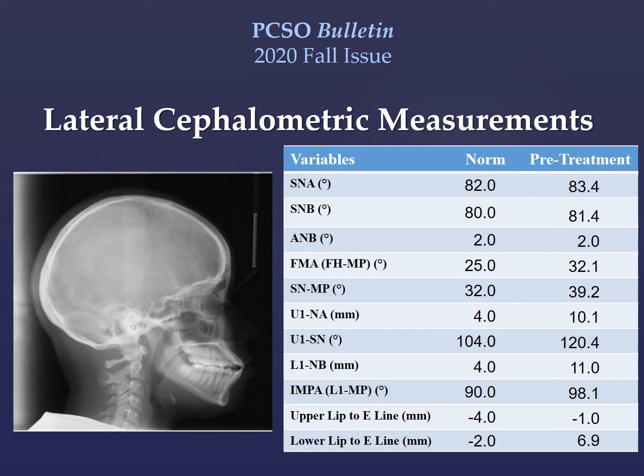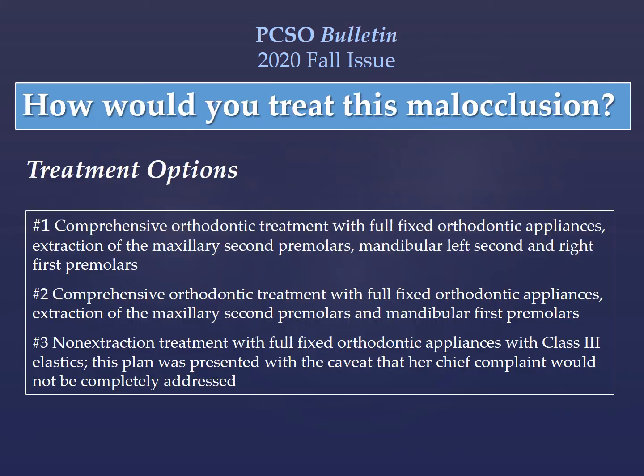The patient's cephalometric evaluation reveals a slight class 3 tendency with a Wits appraisal of -2 millimeters, an ANB of 2 degrees, and an increased mandibular plane angle. The appearance of double borders of the mandible on the cephalogram supports the previously noted observation of a potential skeletal asymmetry with her chin deviating to the left of her face when viewed on her frontal photo. The patient's cervical vertebral maturation stage was determined to be CS6, which means the patient's peak in mandibular growth has ended at least 2 years before this stage.